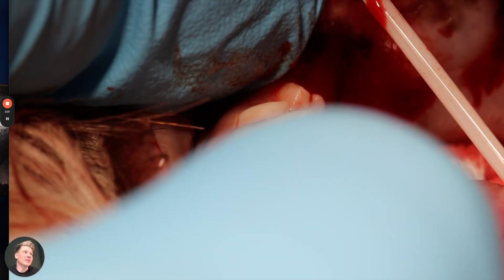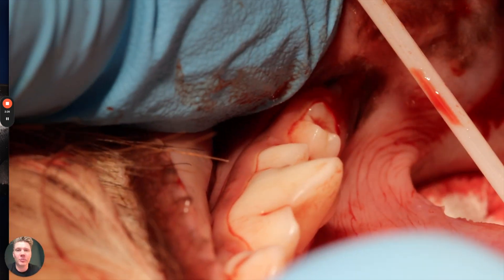You can put a single suture across if you want, or you can leave it open — it will heal quite fast. I hope it helps. Thank you.